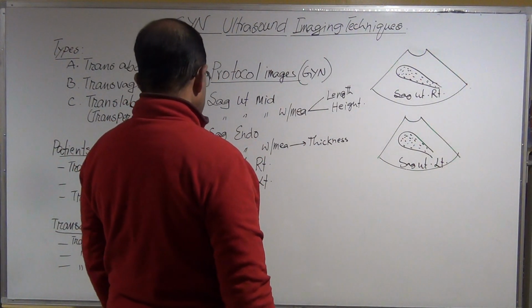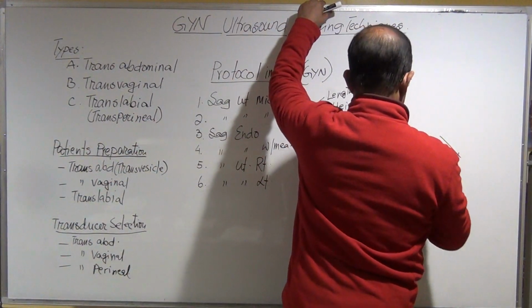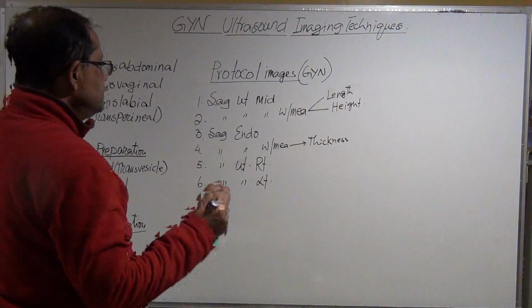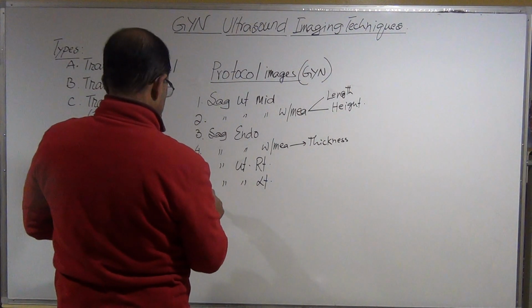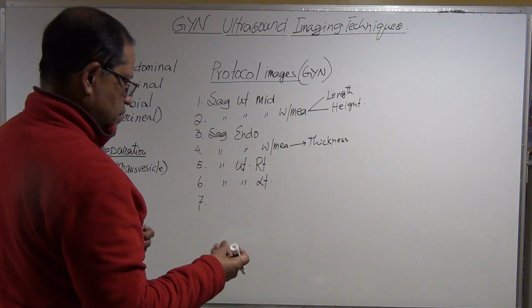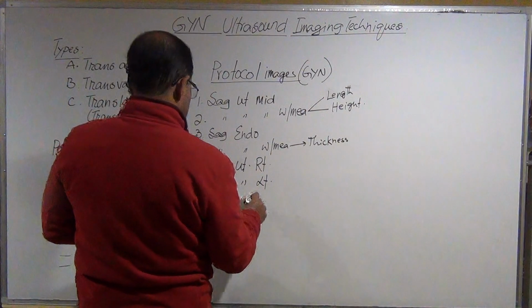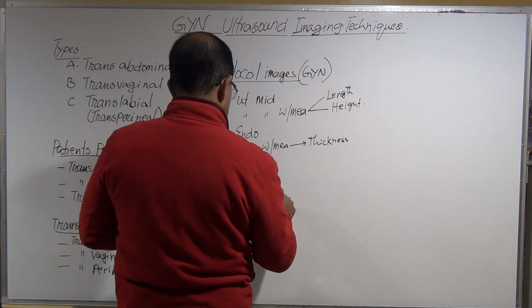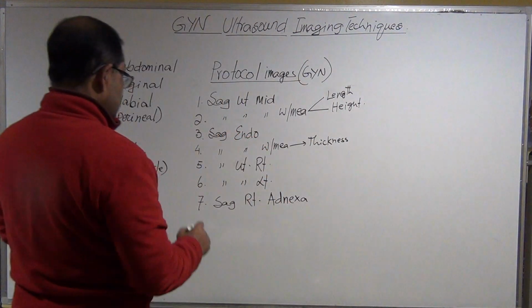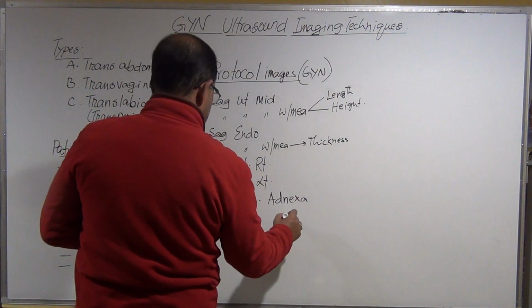Okay, and next is says right adnexa and says left adnexa.